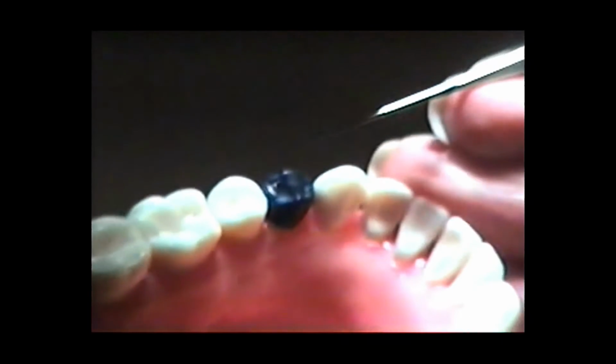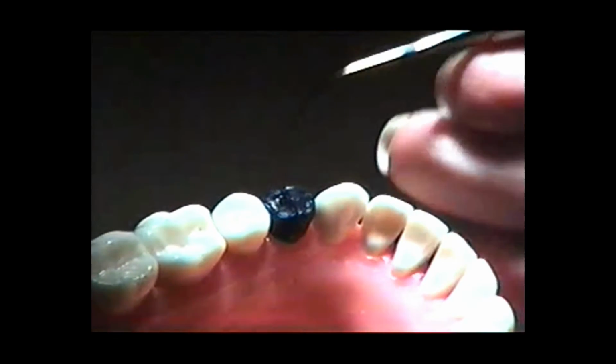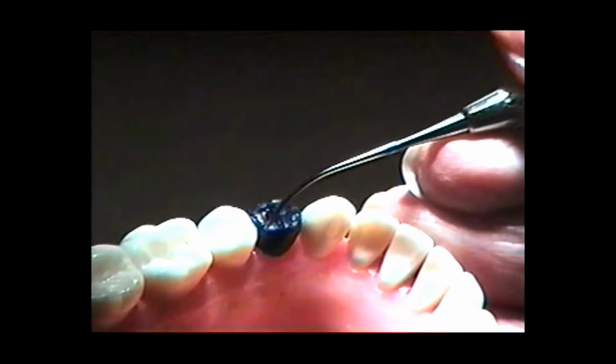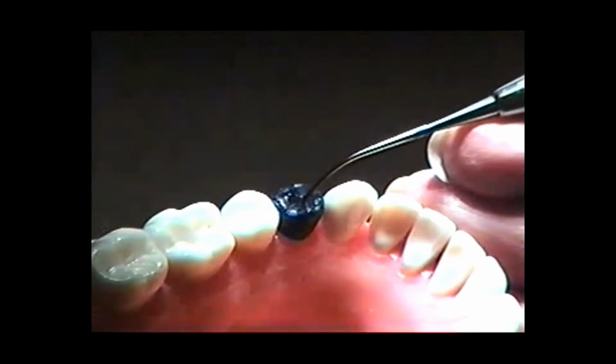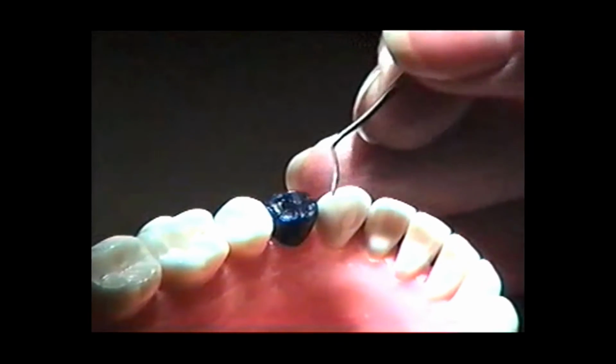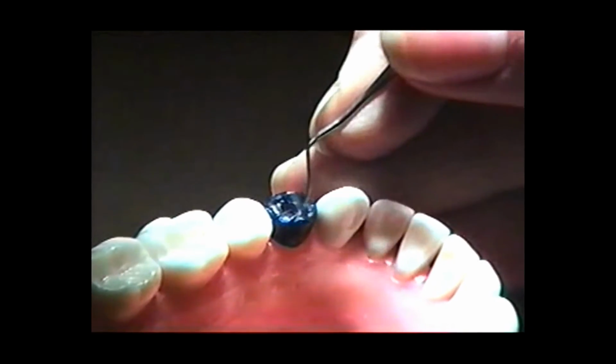Again, whenever I add wax at this point, because I'm close, I go ahead and I recheck. I don't have a contact on my, here we go, here's something you can look at. I don't know if we can see it, but right here's a dent from where I put the occlusion together, and now we know we need it kind of on the marginal ridge, we need a contact. So what I'll do is leave this area and not carve back that part of the waxing, but up here where I was coming in and I'm still getting that dent, I'm going to move that cusp tip perhaps a little bit mesially, so that I don't get occlusion right there, because I don't want it there.